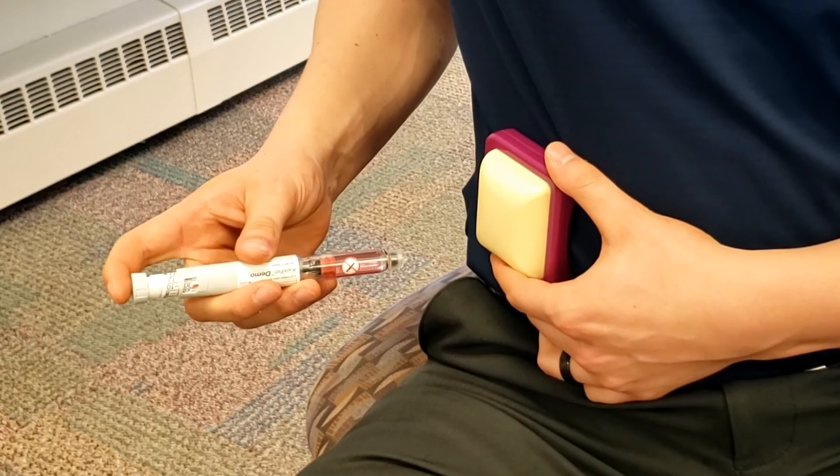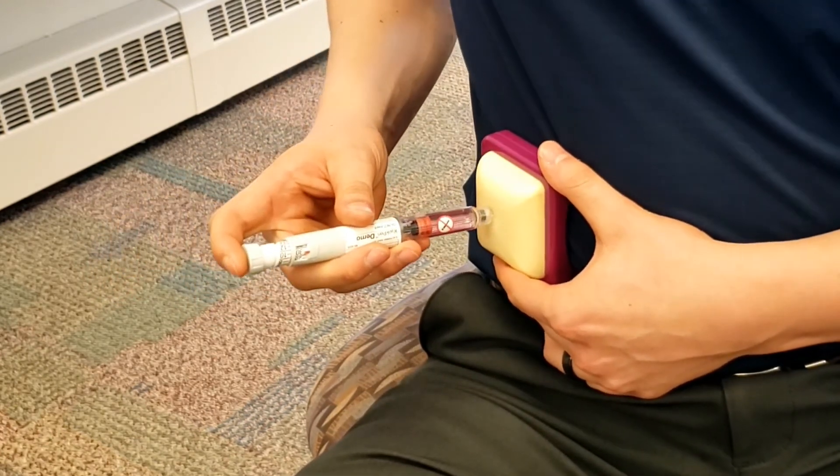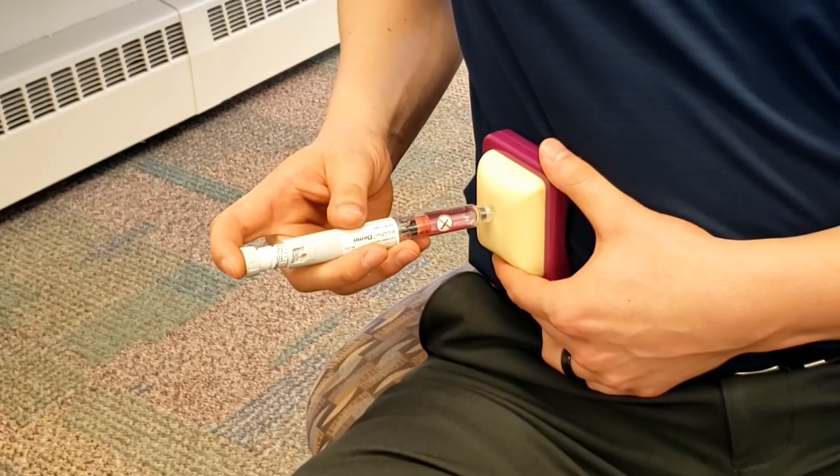To perform the injection, you need to poke the needle straight into your skin at a 90 degree angle.